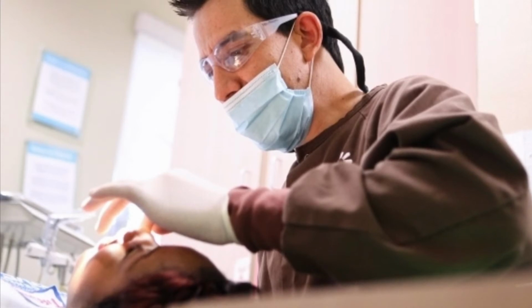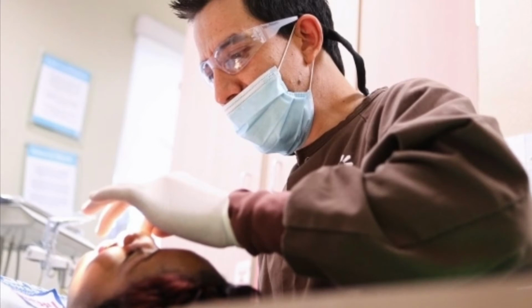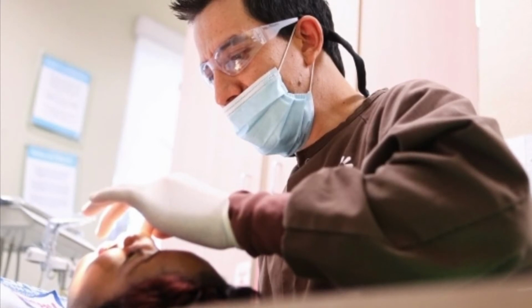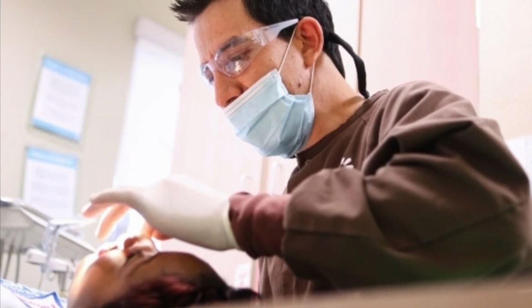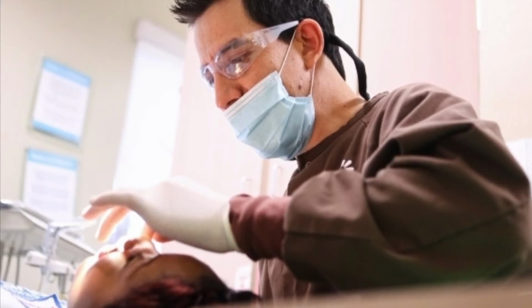The working length is necessary because it establishes the length of the tooth at which the canal preparation and subsequent obturation are to be completed. Again, to establish the length of the tooth at which the canal preparation and subsequent obturation are to be completed.